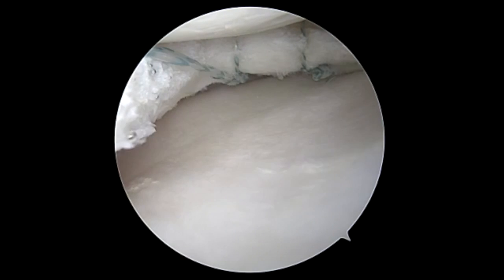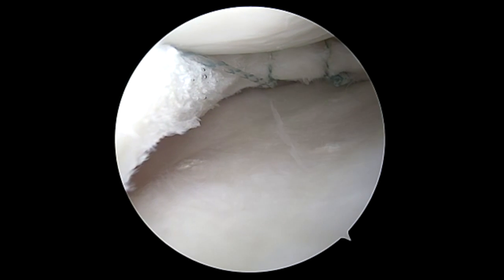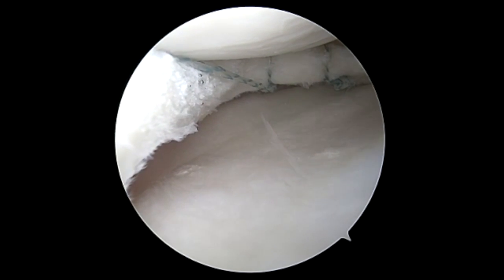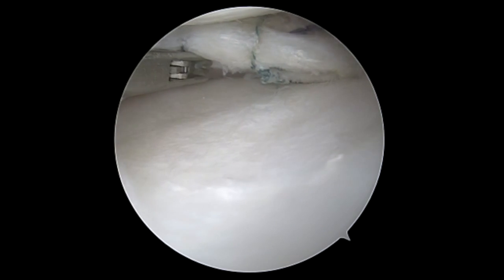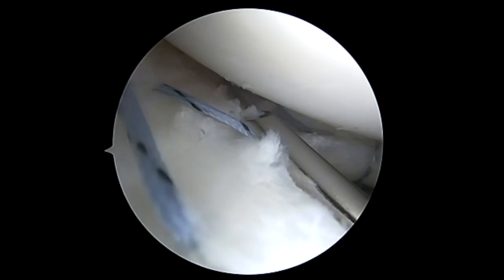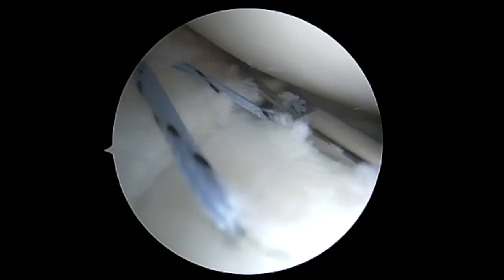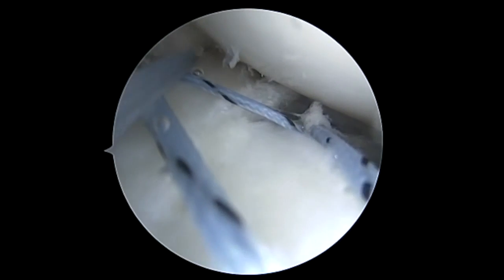Here you can see sequential half hitches. We're really compressing this meniscus back together with the hopes of potentially healing. We're going to cut this, and then we're going to replace one more vertical mattress suture. We placed a few inferiorly as well, and this is going to compress the entire fragment.